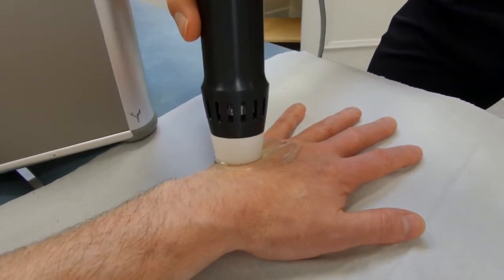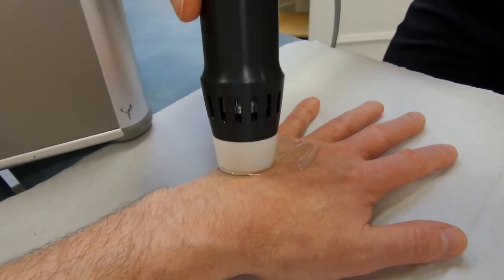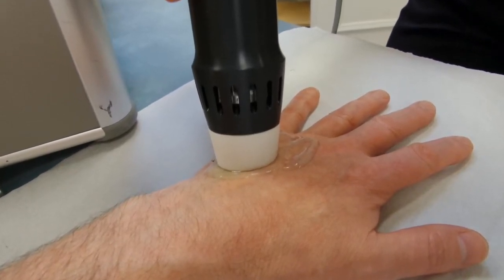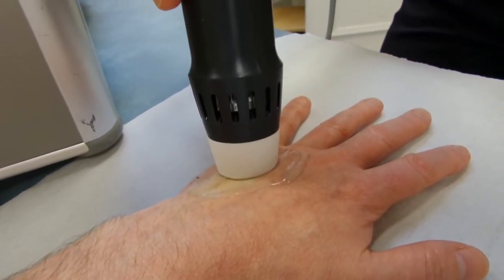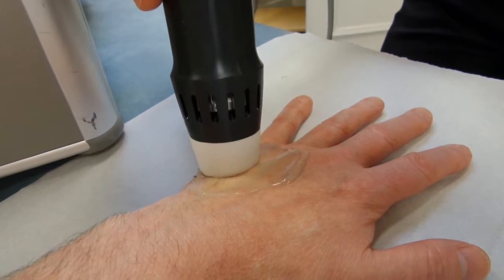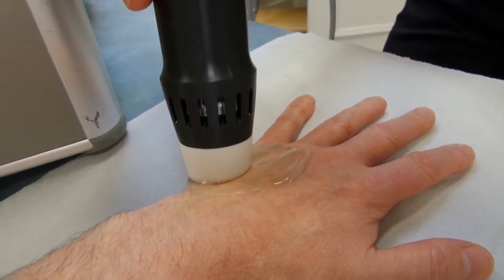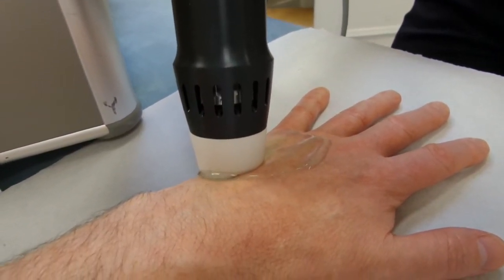I pressed the foot plate to begin shockwave therapy. As you probably just heard there, I have placed the foot plate and the shockwave therapy didn't immediately begin. It's because sometimes I don't press the foot plate correctly. We're going now.